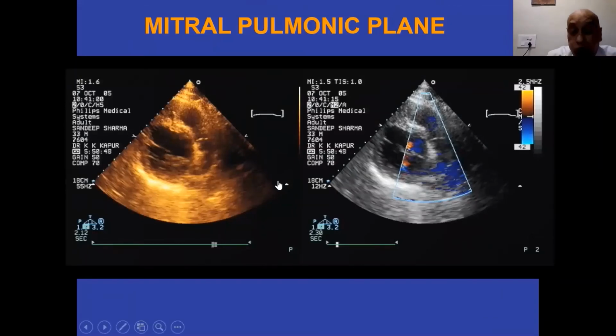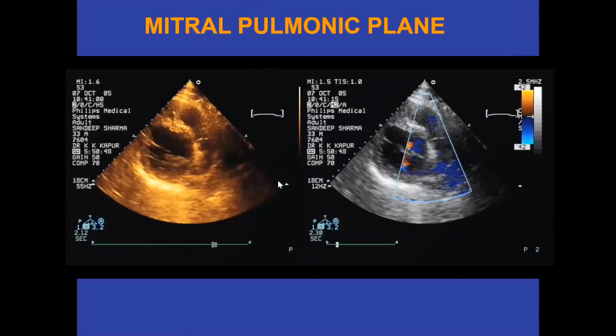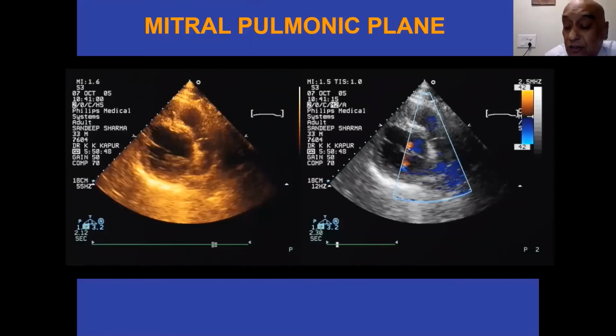Now the other question that was asked, this was the second question you had told me. Yeah, so just give me 1 second. There are so many questions. No, this was: could you repeat the site of transducer placement in the right lower parasternal view and imaging from the back? Yeah, so I'll show you here this right lower.